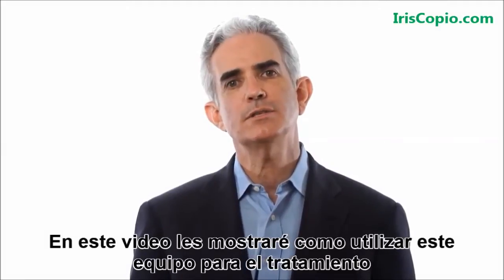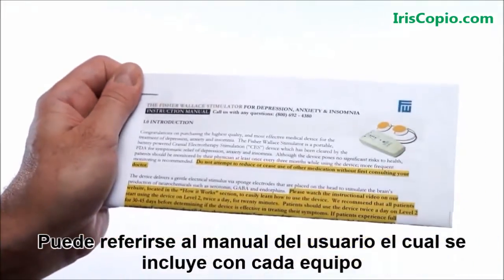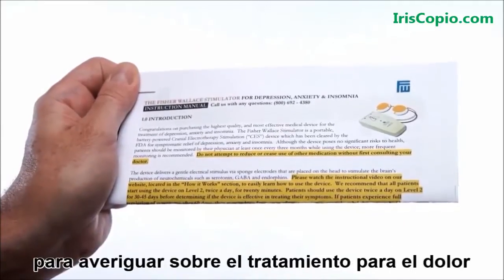In this video, I'll show you how to use the device to treat depression, insomnia, and anxiety. You can refer to the instruction manual included with every device regarding the treatment of pain.